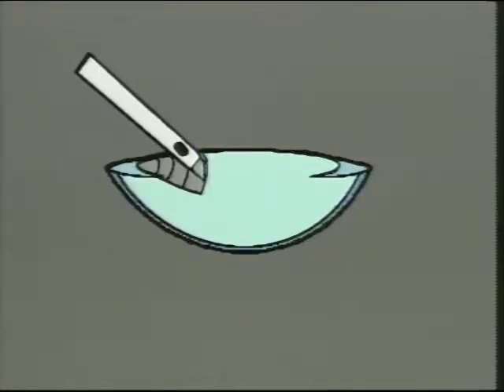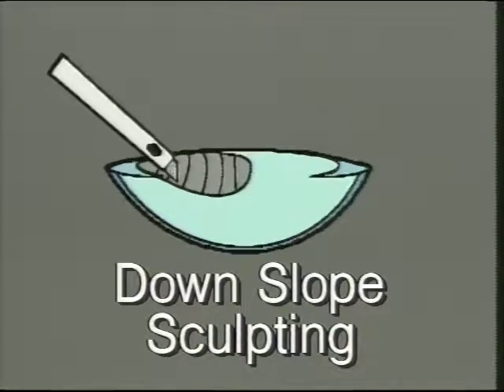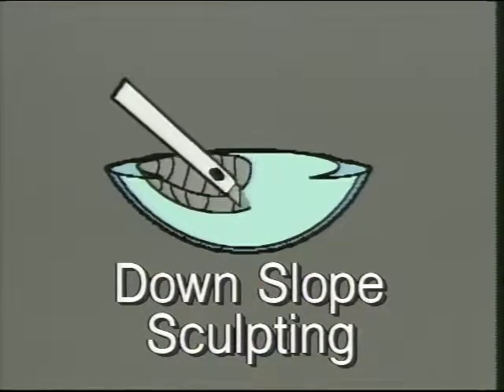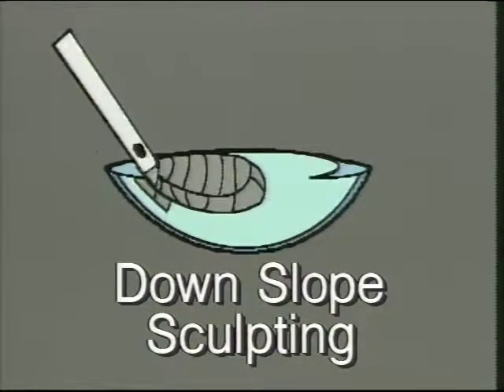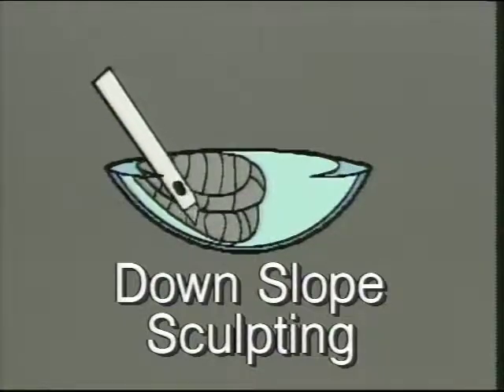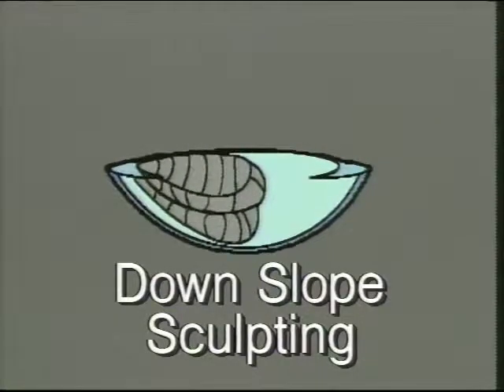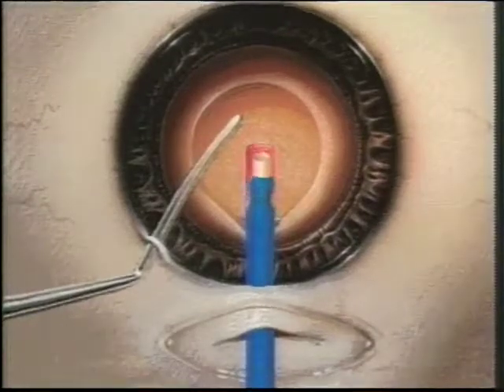Relatively complication-free surgery in small pupil cases can be achieved with nucleofractus phacoemulsification techniques. Due to the limitation of the size of the pupil and the capsule opening, I've developed a slight variation on the traditional sculpting method I've been employing with the nucleofractus techniques. I call this modification down-slope sculpting.